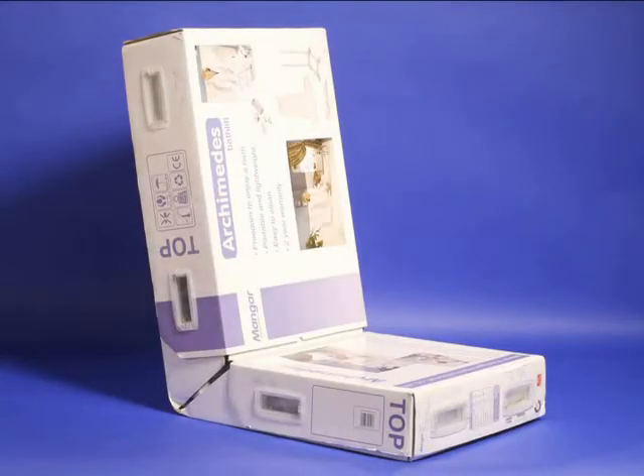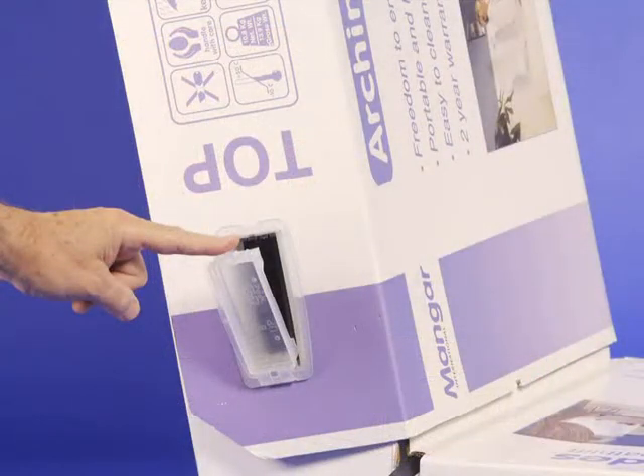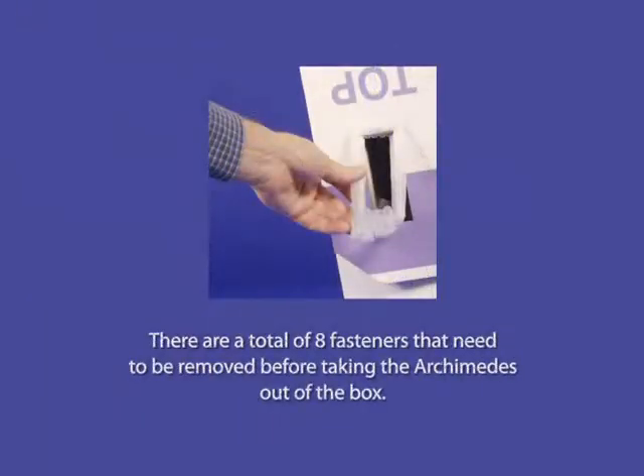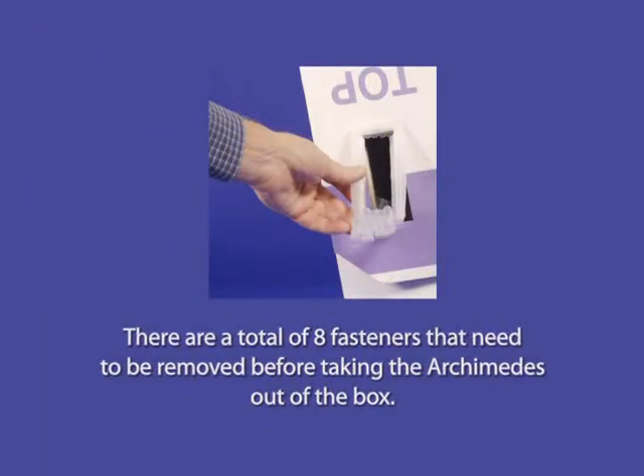The Archimedes bath lift arrives in a distinctive box. To open the box, lift up one of the tabs, then remove the fastener from the box. There are a total of eight fasteners that need to be removed before taking the Archimedes out of the box.